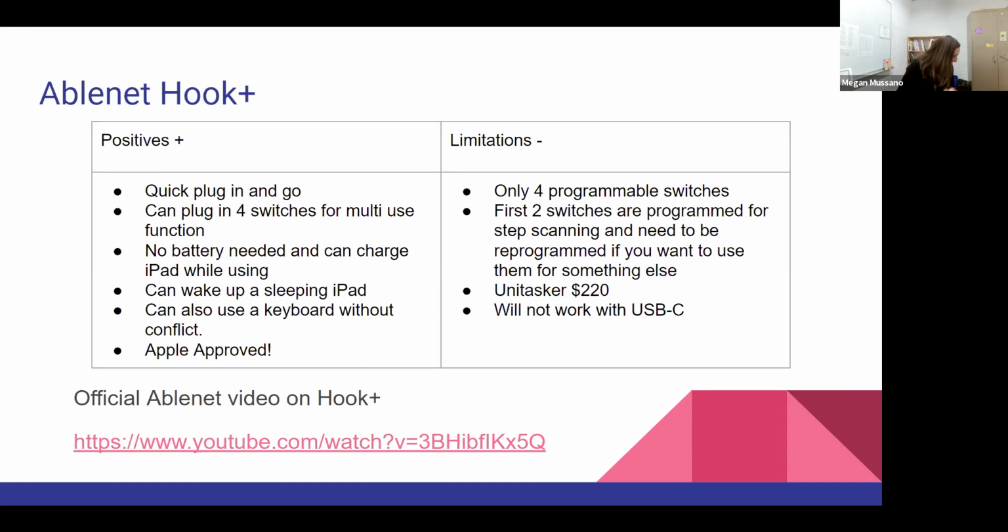So the first one I want to talk about is the AbleNet Hook Plus. The AbleNet Hook Plus is one piece that you can buy actually directly from AbleNet. One of the positives about this is that you can quickly just plug it in the iPad and then you directly plug up to 4 different switches into the Hook Plus. So it's one of the more foolproof adapters, or the quickest ways to make an iPad Switch accessible. You don't need a battery, or you can charge the iPad while this is in, which is nice because it has the charging port on the bottom in case your iPad is dead.